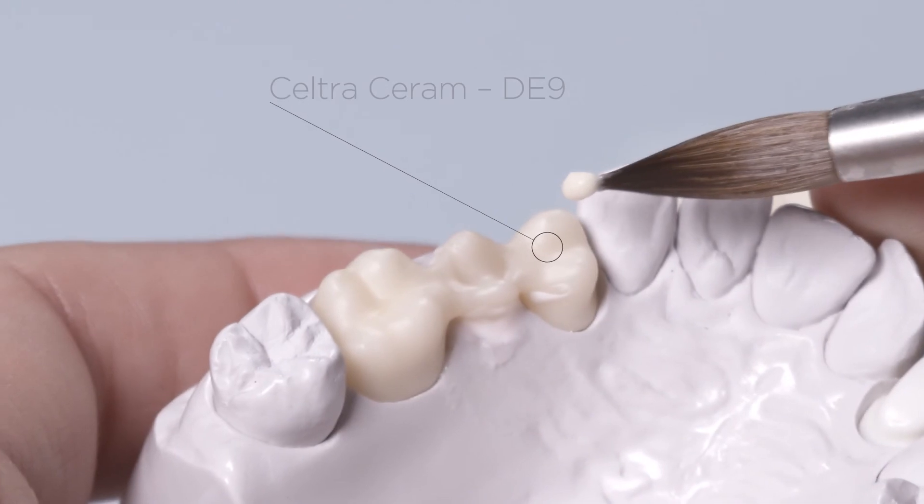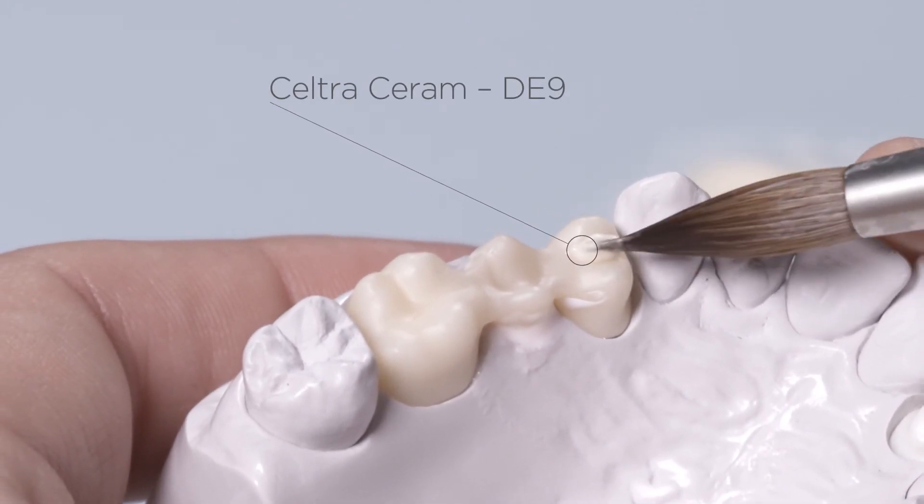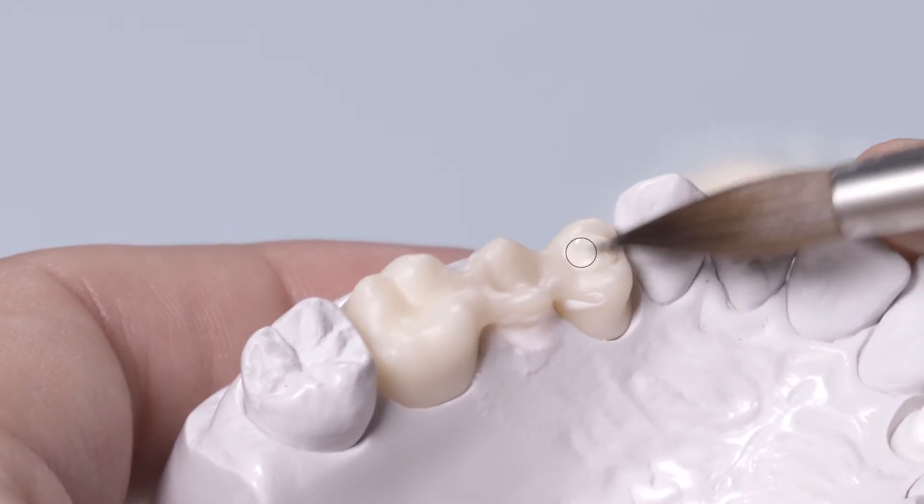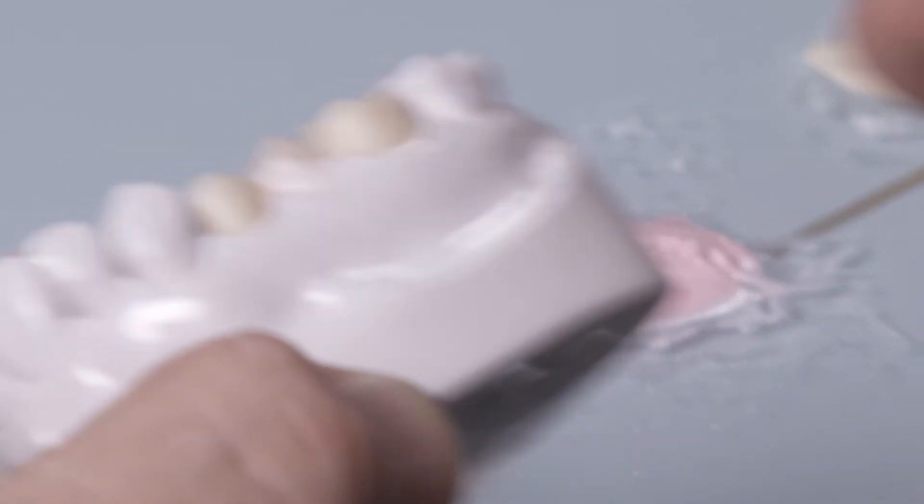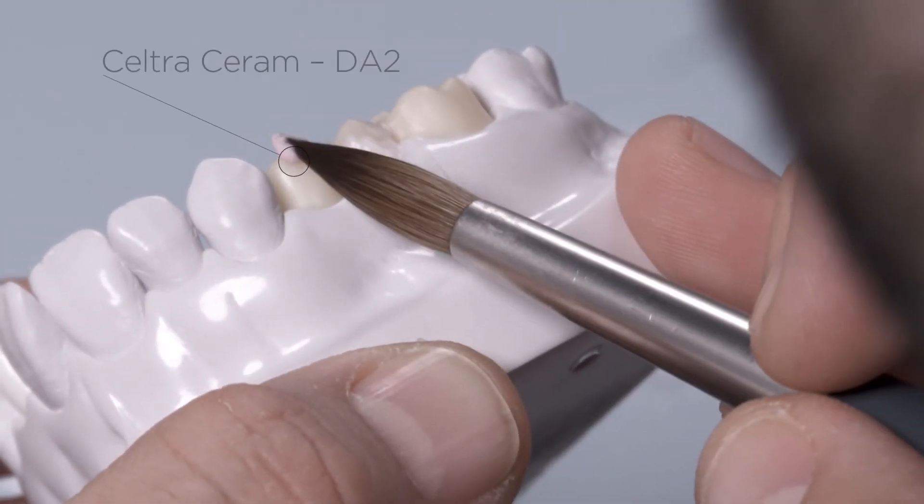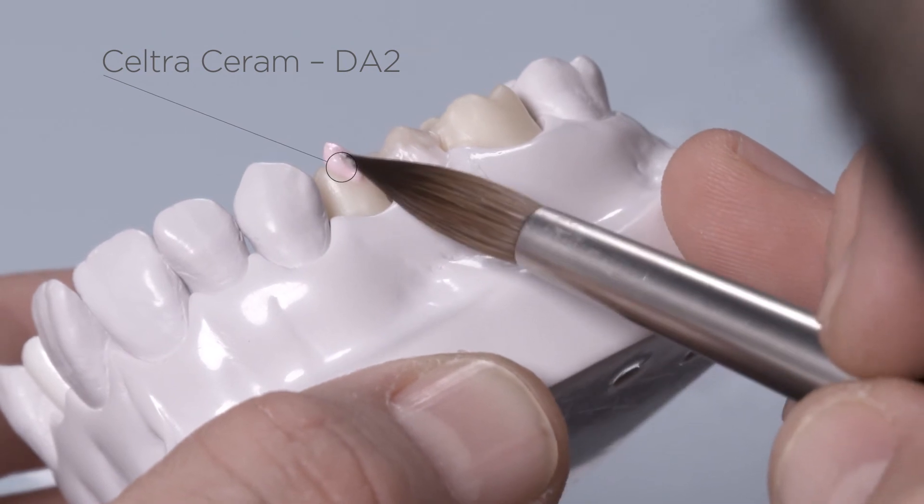Place Dentin Effect DE9 Orange in the central occlusal areas of the restoration. Then build up the buccal, labial and occlusal dentin aspects with Dentin A2.